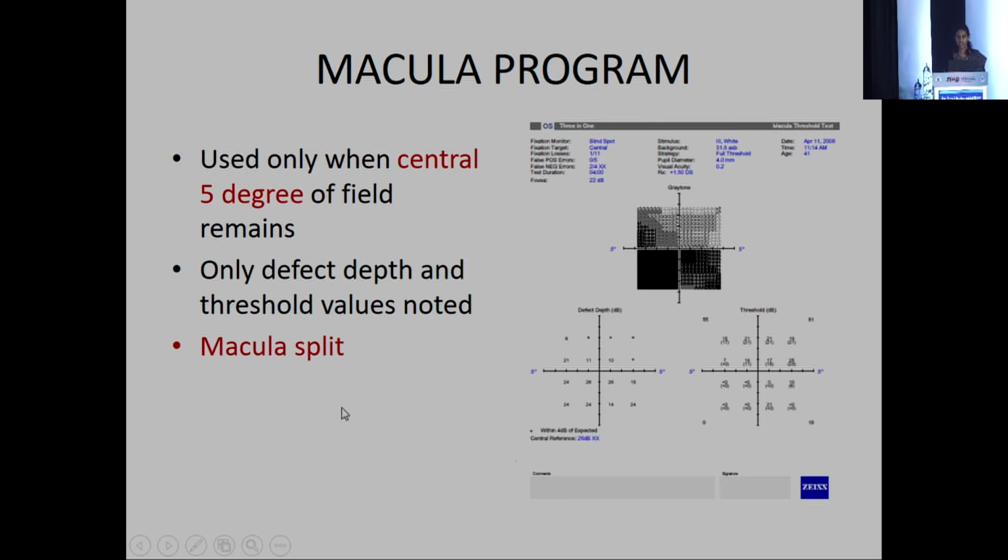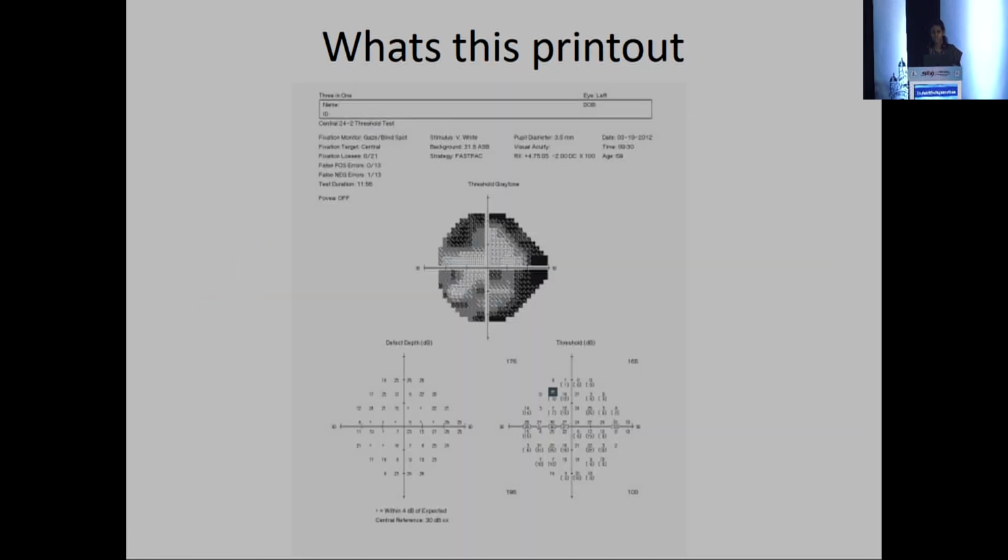Macula program is used only when central 5 degree of the field remains. If you are looking out for a macula split, get the macula program done. What is this printout?